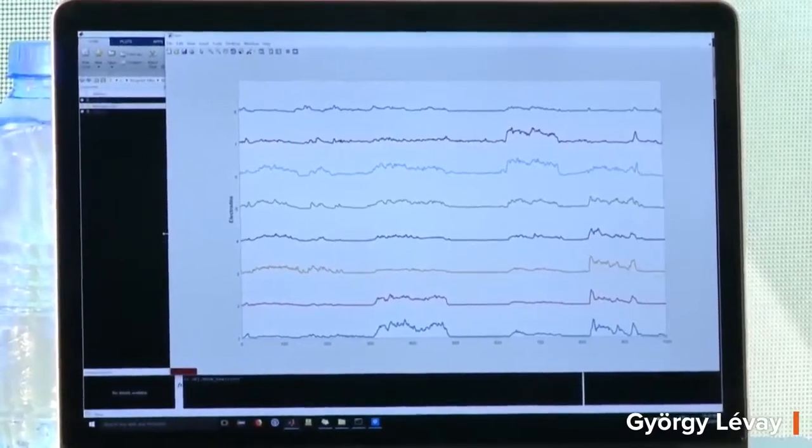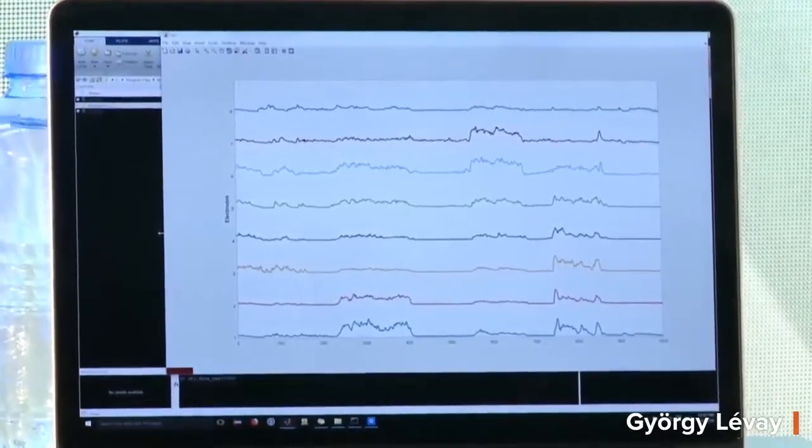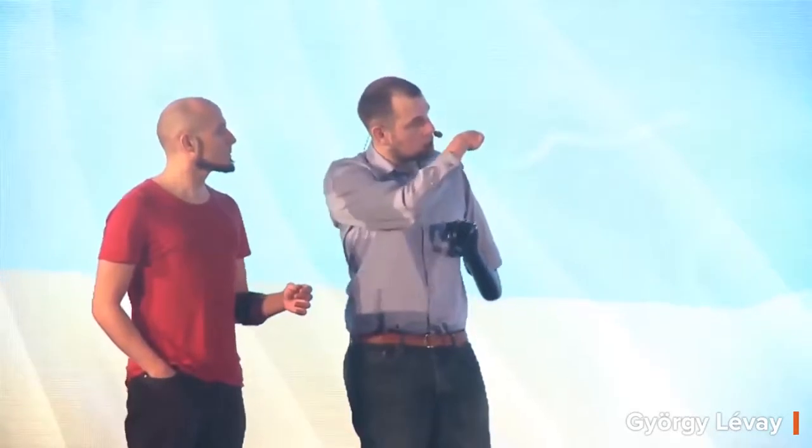So you can see these different areas where you're getting that different pattern of signals. And we're going to teach a machine learning algorithm to recognize that. But there's something very important, though, is that even when he's resting and not doing anything, he's still getting signals, right? So from the machine's perspective, that's as much a movement as any other, even though for us it's, of course, not. So it's very important that your rest stays consistent and doesn't activate anything, because that's what it's going to learn to make sure that when you're not doing anything, it knows that you're actually not doing anything.